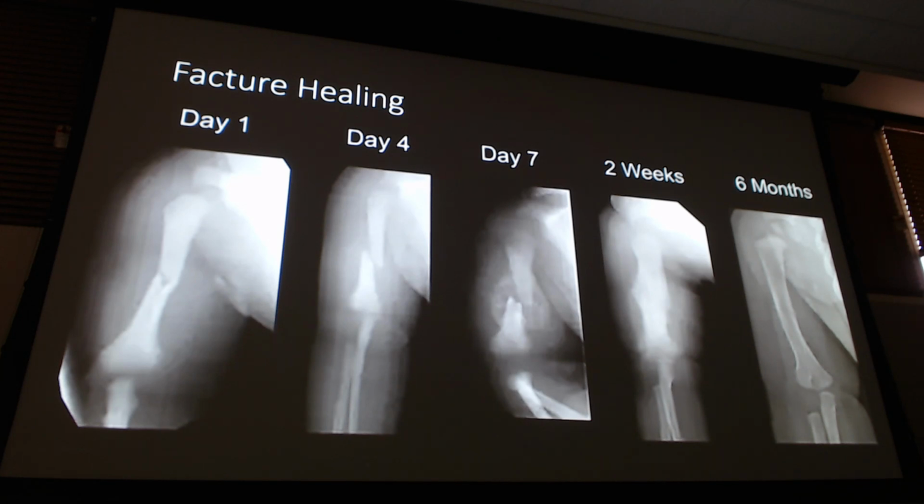But just to kind of show you how you can trace this yourself, right? If it's your patient. First picture, I would still send to ortho and be like, hey, do you guys need to see this? They're probably saying no, probably not. On day 4, they were like, we'll do another one in a couple of days to see how it's doing. And then here they probably aren't seeing the kid anymore. You're gonna keep an eye on it. They just keep doing the x-rays, right? They'll be in a cast, obviously, this whole time, and you see how quickly it heals. So just see that stepwise process.